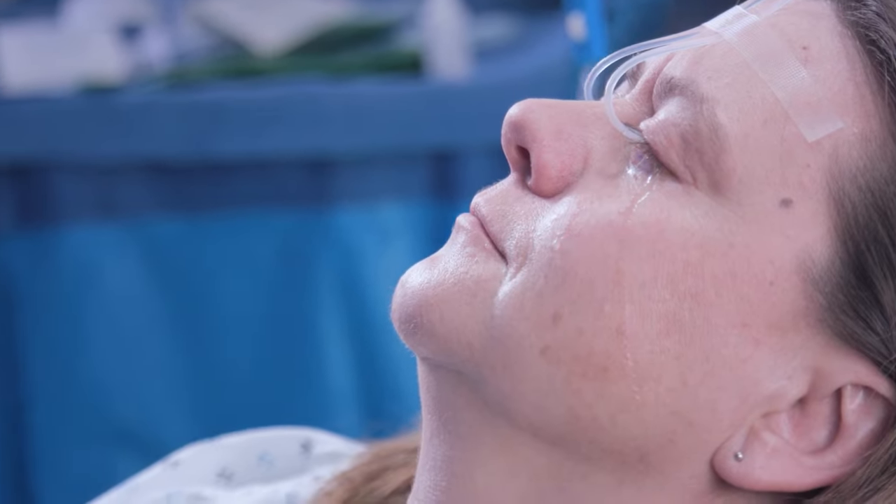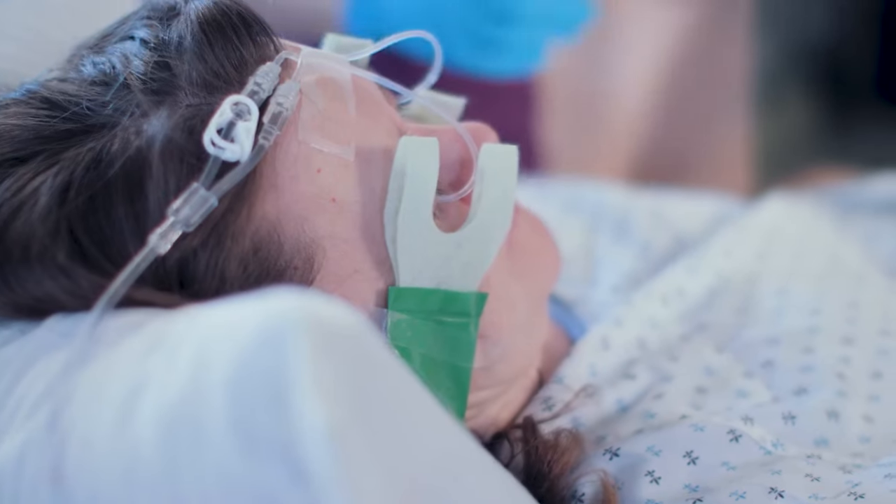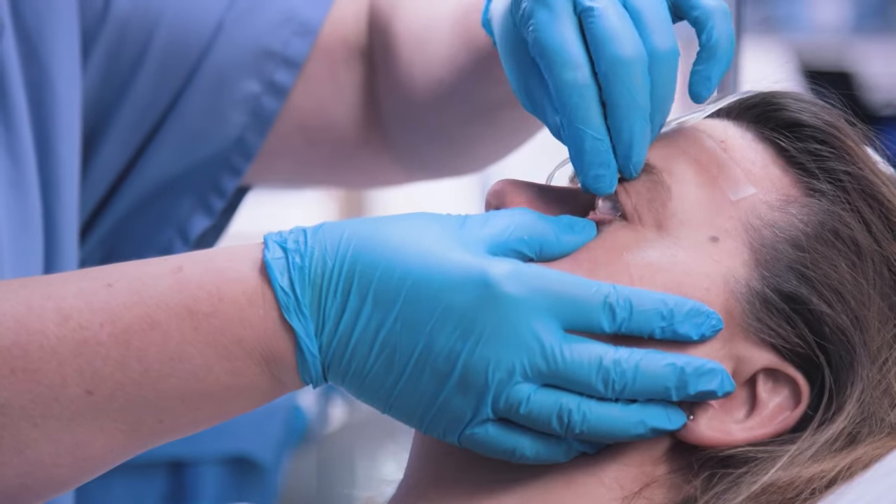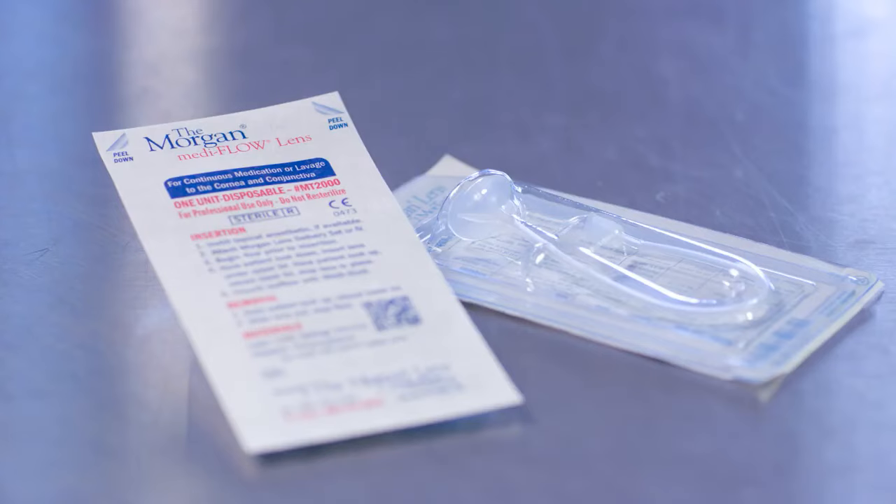When treating severe infections, doctors have used the Morgan lens for continuous eye irrigation for seven to ten days or more, removing them only long enough to examine the eyes.